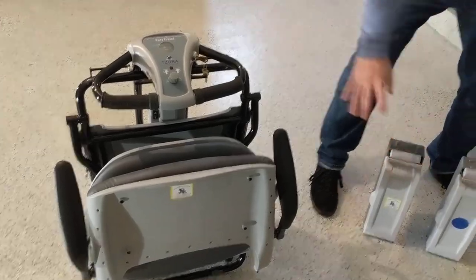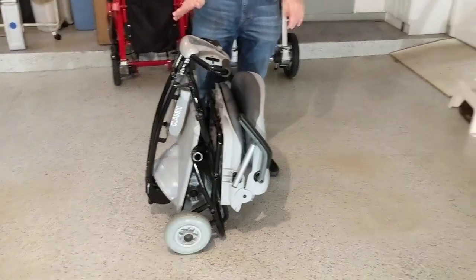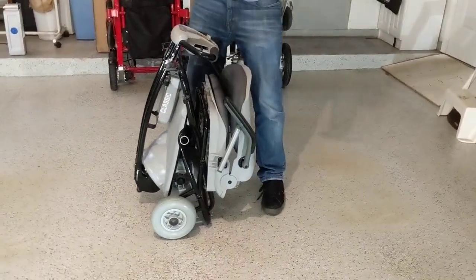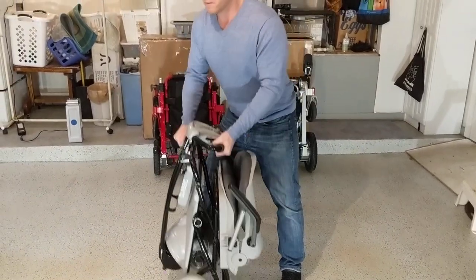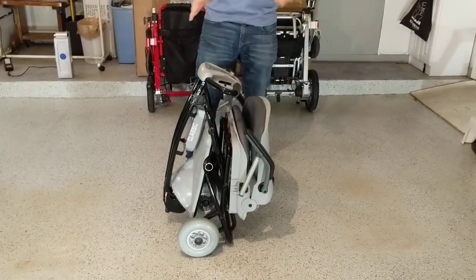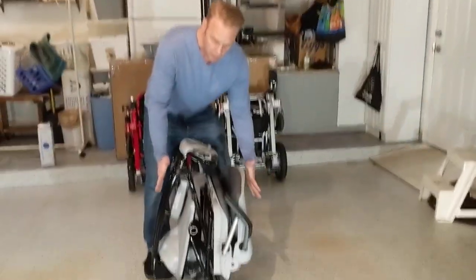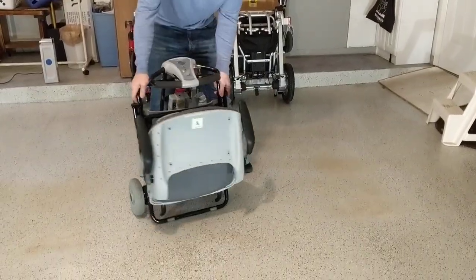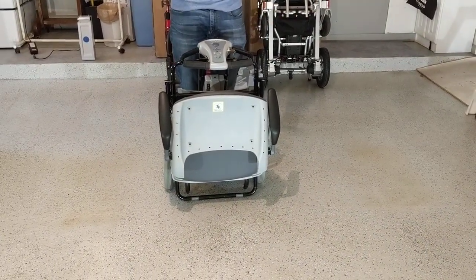If we take a view from the outside of this device, I want to point out that we're looking at about 54 pounds, as is. 54 pounds — obviously I'm in fair and decent shape, but look at how small this is. It literally is about the size of maybe a medium-sized suitcase, and it gets even smaller.